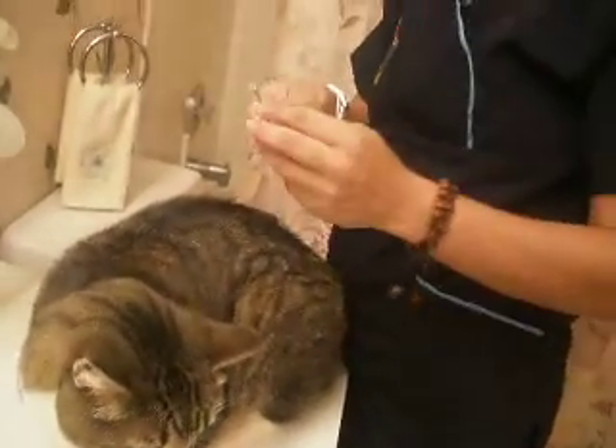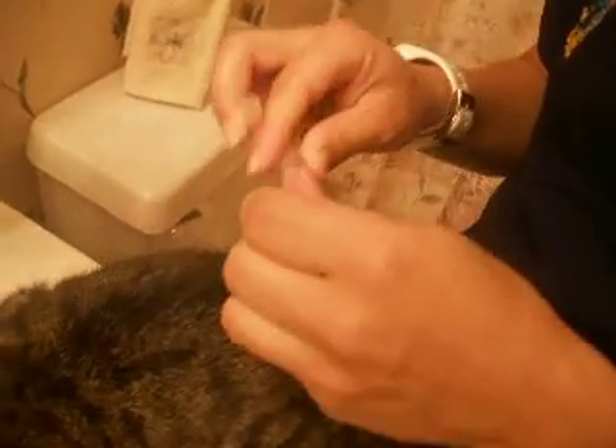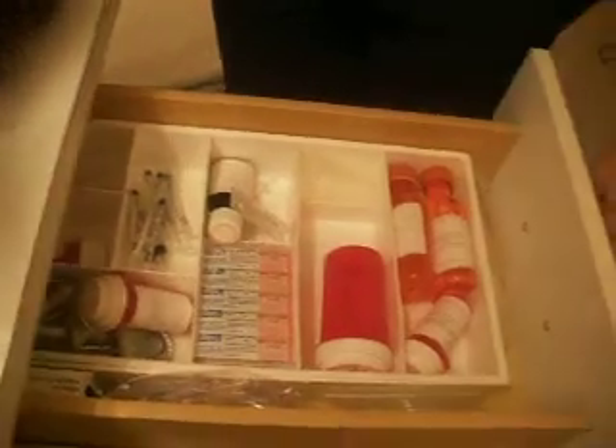I'm getting ready with a new needle to change it. I just got it — a 19 gauge needle. I'm going to take the old one and replace it with the new one. Each time that you give fluids, it's good to have a brand new needle in order to keep it aseptic for your kitty cat and not bring infections to them.